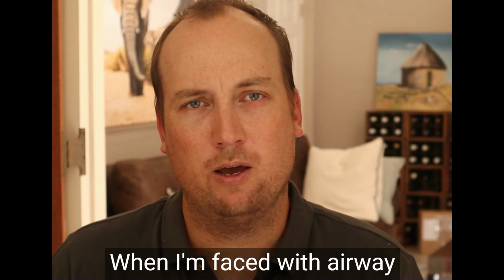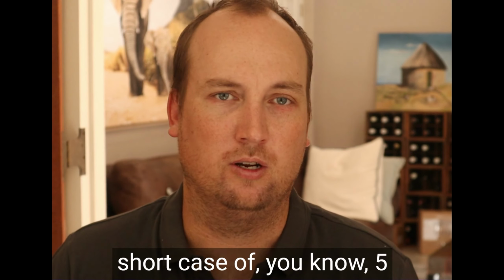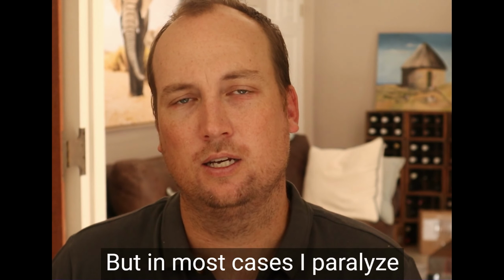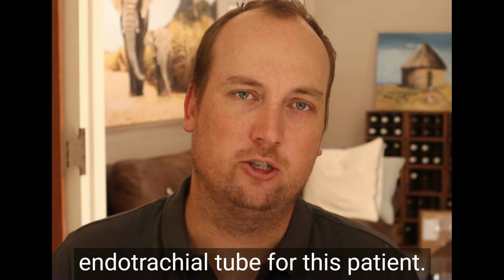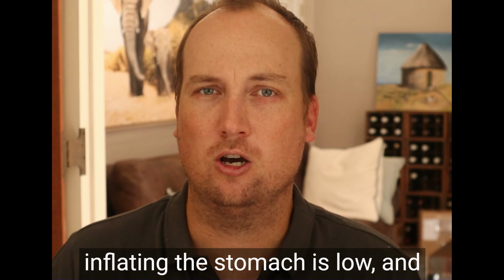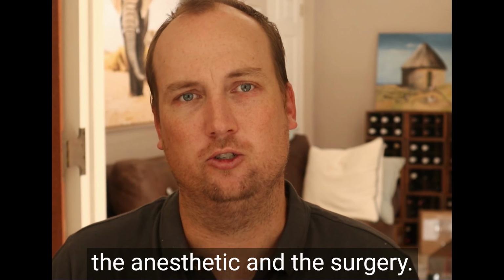When I'm faced with airway pressures like this, if it's a very short case of 5 or 10 minutes, I may persist with the supraglottic airway, but in most cases, I paralyze the patient and I change to an endotracheal tube for this patient. And then I know that the airway is secured, that my risk of inflating the stomach is low, and I can relax and continue with the anesthetic and the surgery.